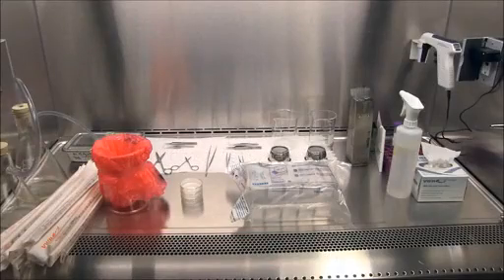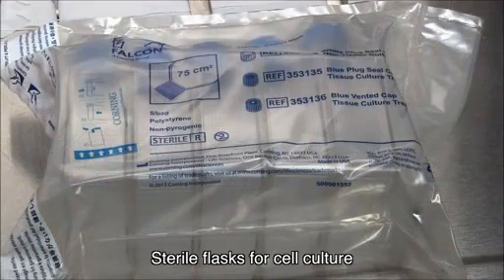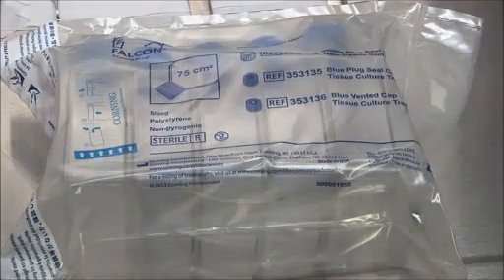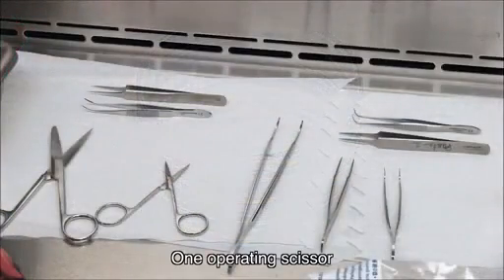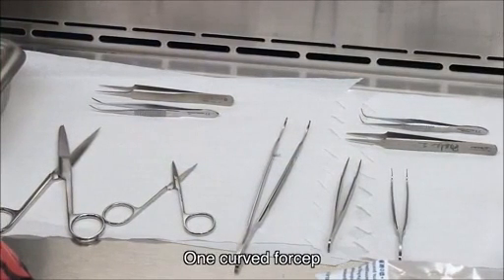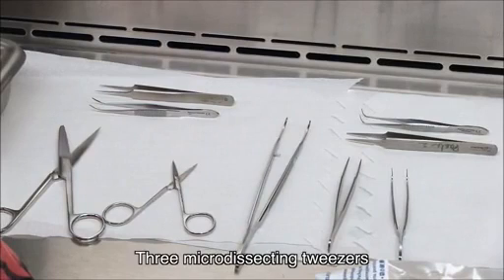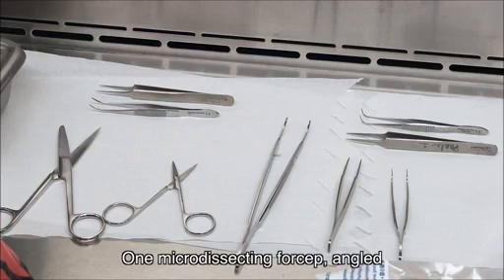The materials required for this procedure are the following: sterile flask for cell culture, sterile 60 mm Petri dishes, 1 operating scissor, 1 microdissecting scissor, 1 curved forceps, 3 microdissecting tweezers, 2 microdissecting forceps slightly curved, 1 microdissecting forceps angled.